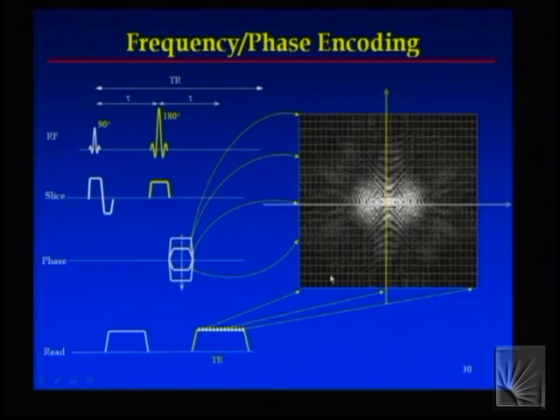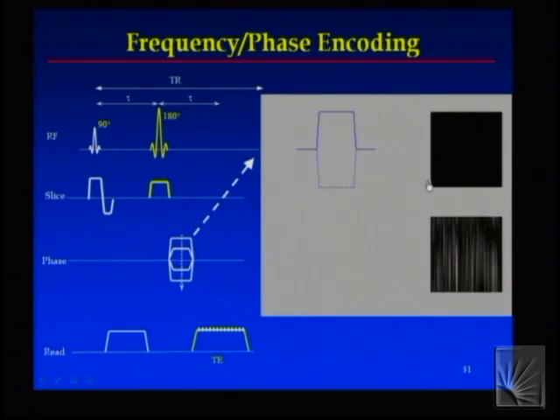Okay, so that's what K-space looks like. This is what MR data looks like before I do the reconstruction. Two-dimensional Fourier transform of this is the image of Dr. Leparo that we're all looking for. And here's what the gradient waveforms do. They simply play out. They define a different line for me.